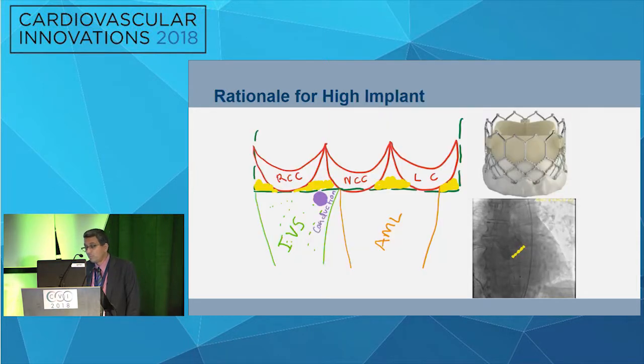So very, very simple. Why it is so important is, of course, that there is a conduction system, and you want to seal the inter-leaflet area. You don't really need to seal the mitral valve. If you have a cuff there, it is not as good, because what are you going to seal there? It is better to seal where you have the intercommissures. And that is what I show in there, where the seal is and where our valve is, that it will seal properly.